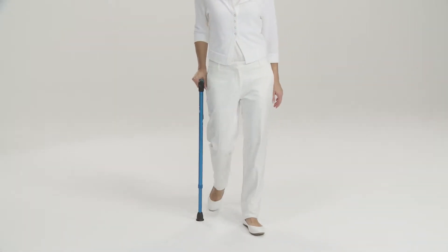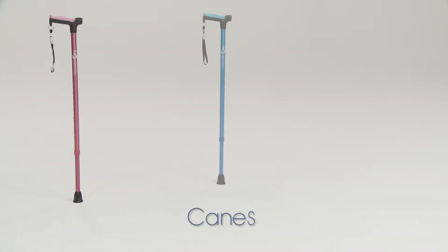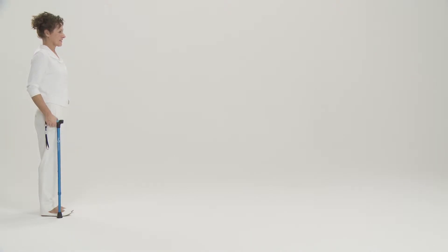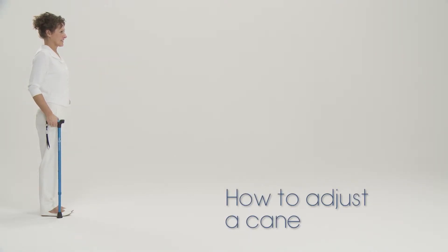A cane is used if you have a minor balance problem or to make it easier to walk if one leg is affected with a slight problem. Here are some tips on how to adjust a cane properly and safely.